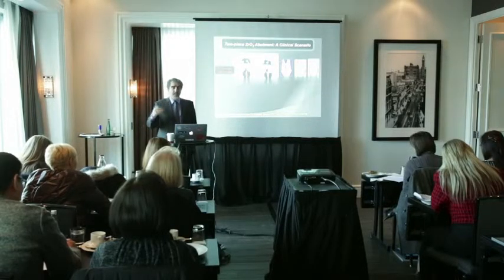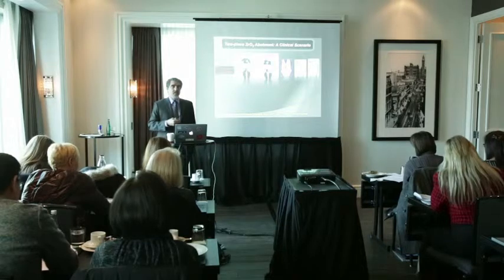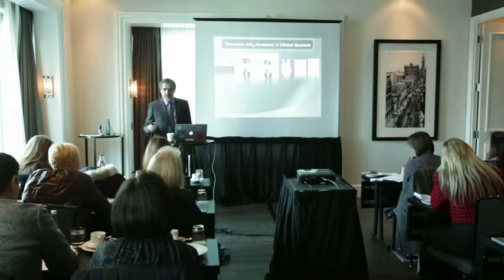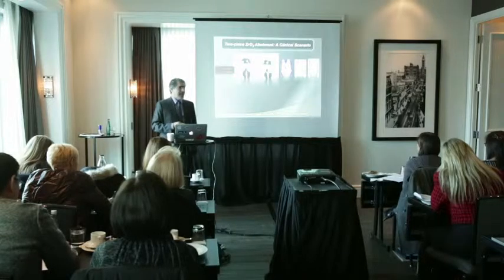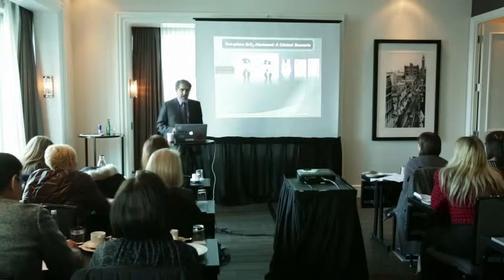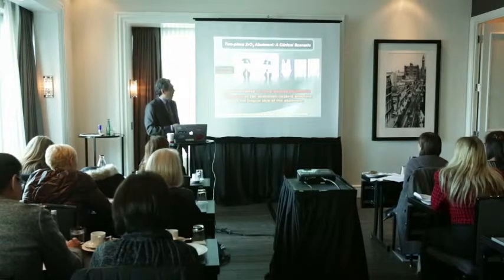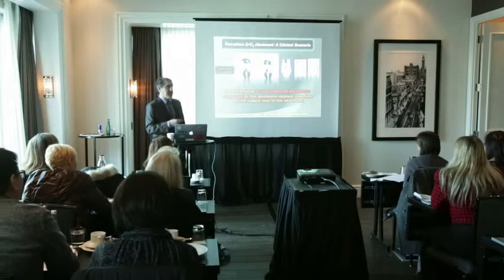So layering the porcelain on the lingual is not going to serve anything. It's not going to give us a better view. It's not going to give us a better biological reaction. It only makes our zirconia weaker, and we have to make sure that the technician is not reducing this area as much as possible.